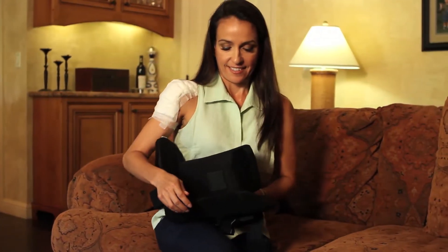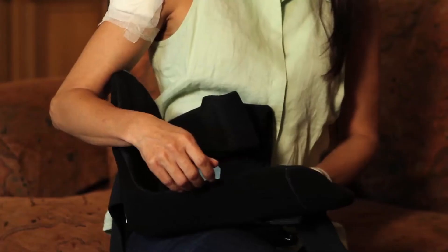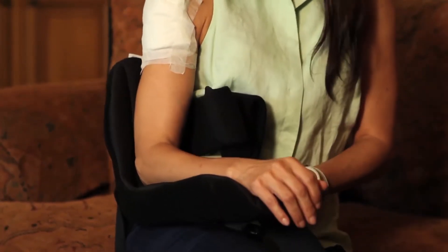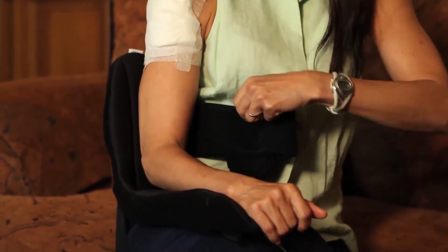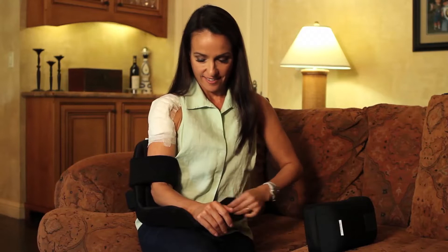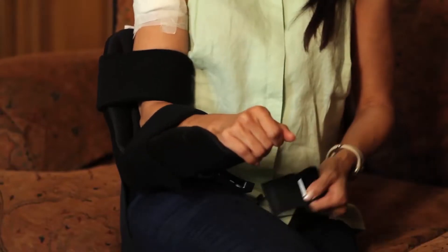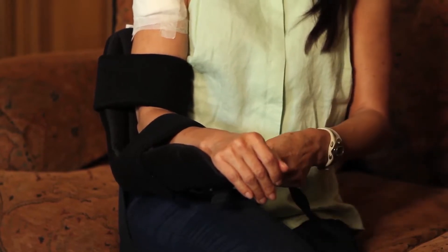The shoulder cradle is simple to apply. First, gently place the arm into the cradle and close the two primary straps — one for the upper arm and one for the lower arm. The wrist strap may also be applied for added security. It is completely removable and may be placed as needed.